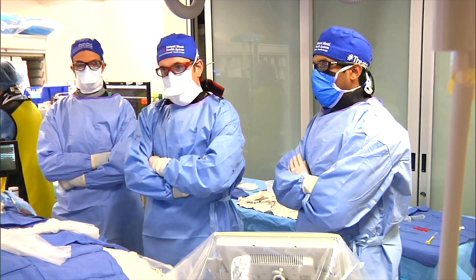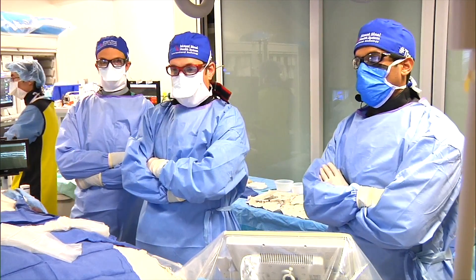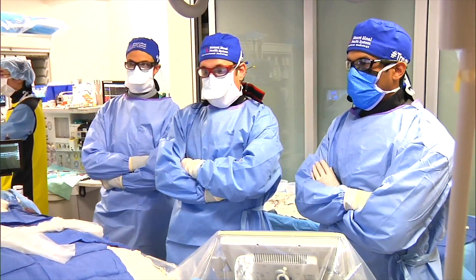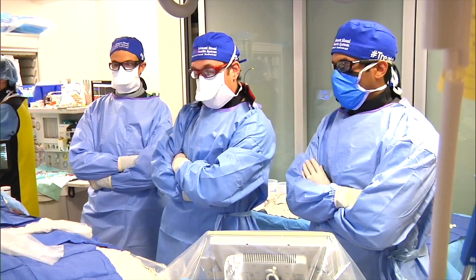Thanks, Brandon. So, a very quick, simple case, but there's a lot of technical nuance with some of these cases, so I want to discuss all that. The first thing I'd like to do is focus in on the wrist, and I'll show you guys where we are so far.